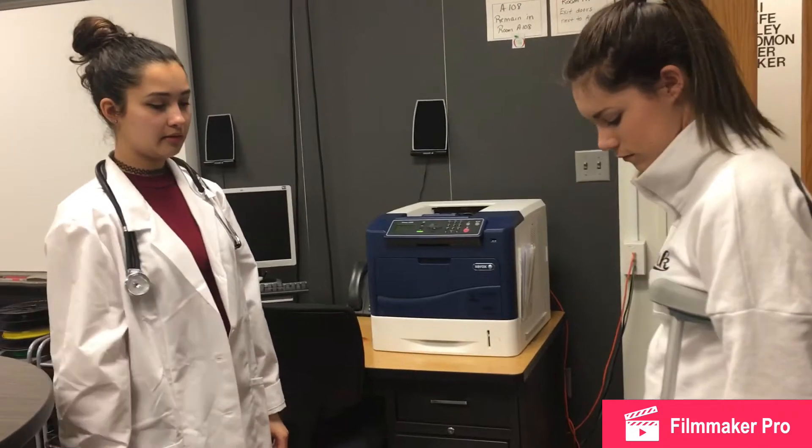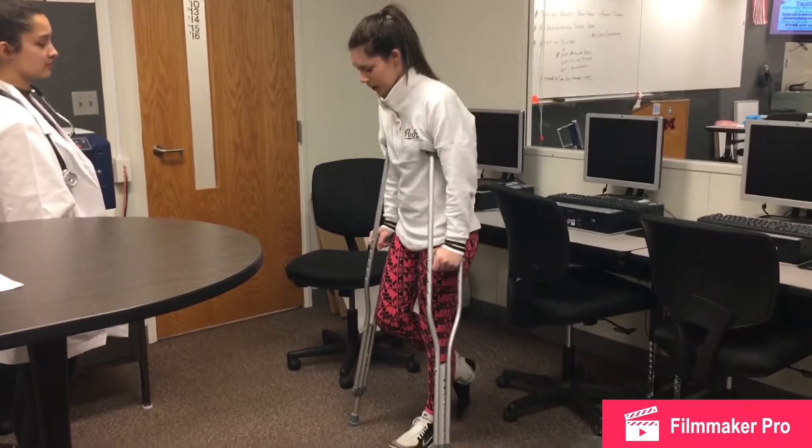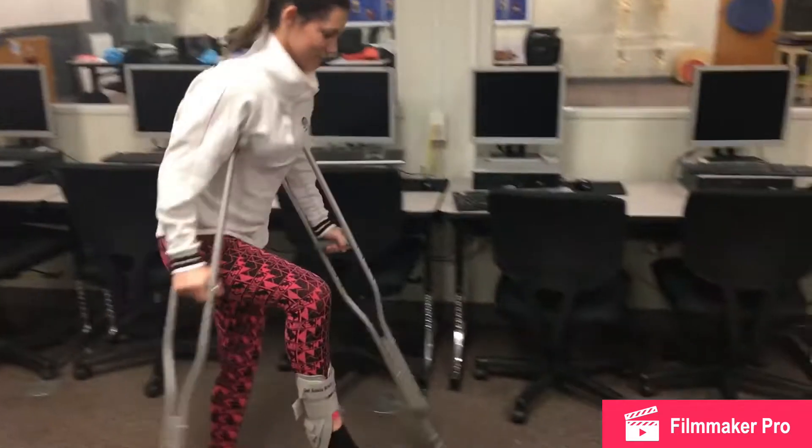You also need to line up your wrist with the handlebar. Next, I'm going to show you how to walk properly. Well, I think I'm capable of doing this myself. That wasn't exactly perfect. We're going to teach you the three-point method, which is a non-weight-bearing method.